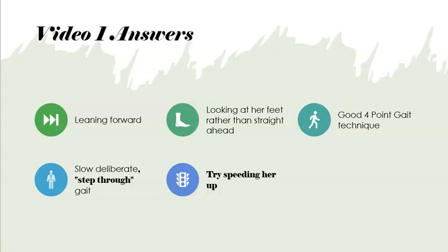So yeah, it's not bad, is it? If we could get her to speed up, that would be good. We're always looking for increased hip extension whenever we have that, slightly better confidence. You'll notice that when all the amputees turn, they tend to pivot on their sound limb and not the amputated side.